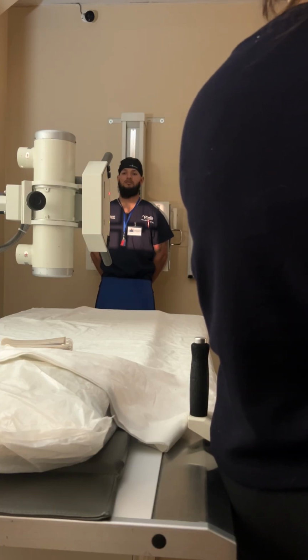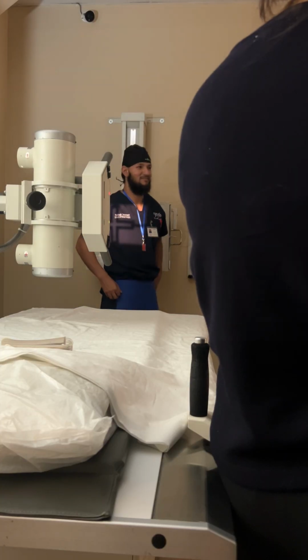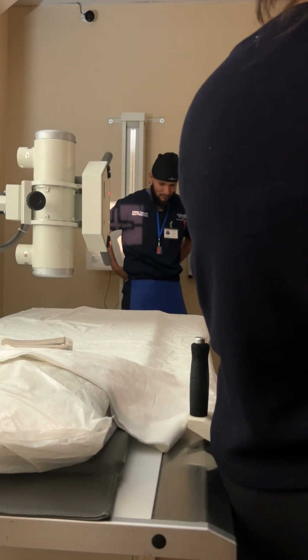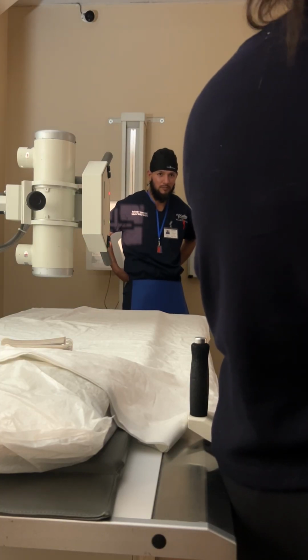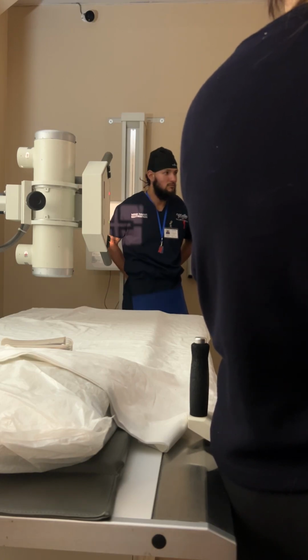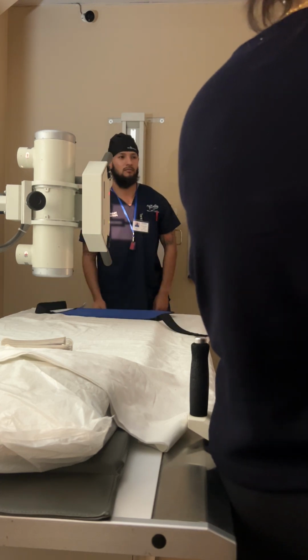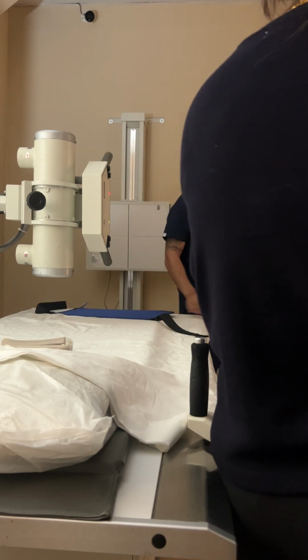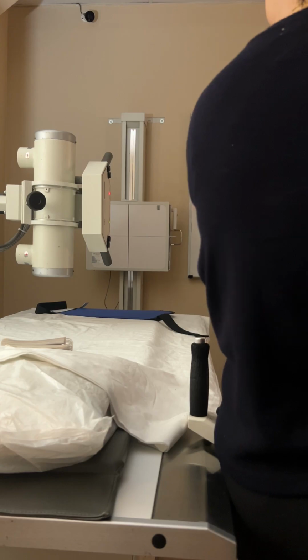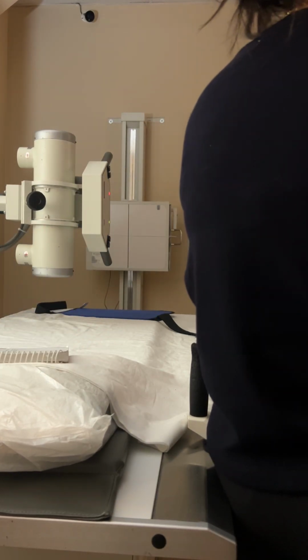Remember what I said about people moving it without pressing the button? Now she's beating up my machine. I'll see if I can get that fixed. They have to WD-40 it every year. You use the same kind of motion that you would use on infant CPR.